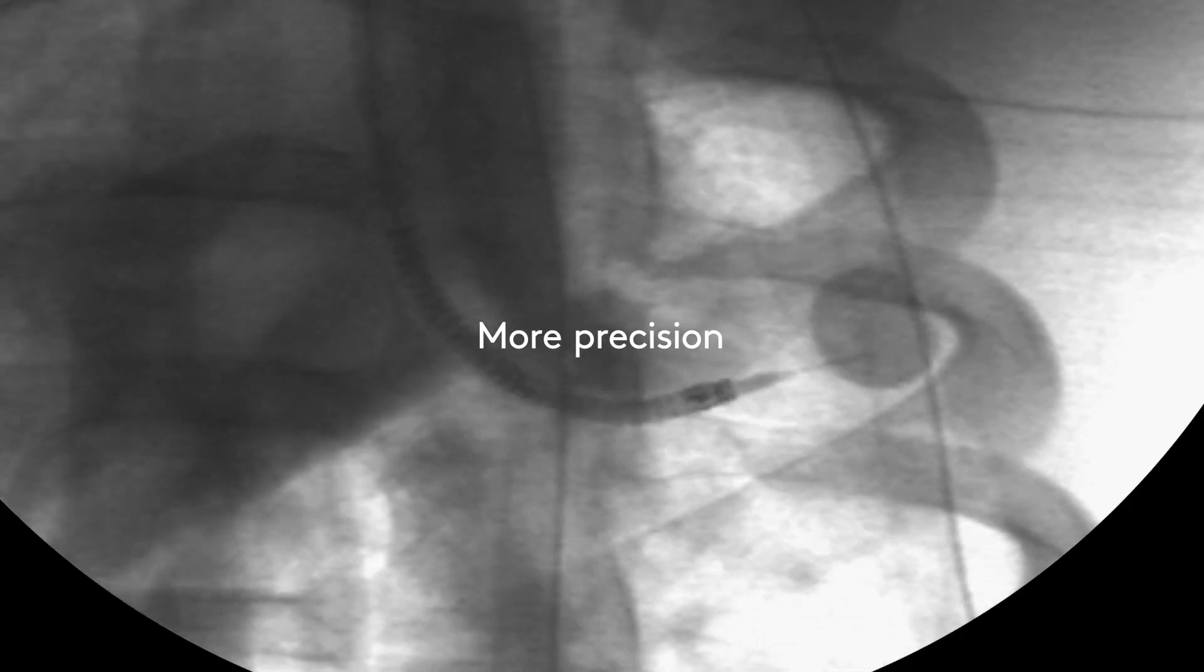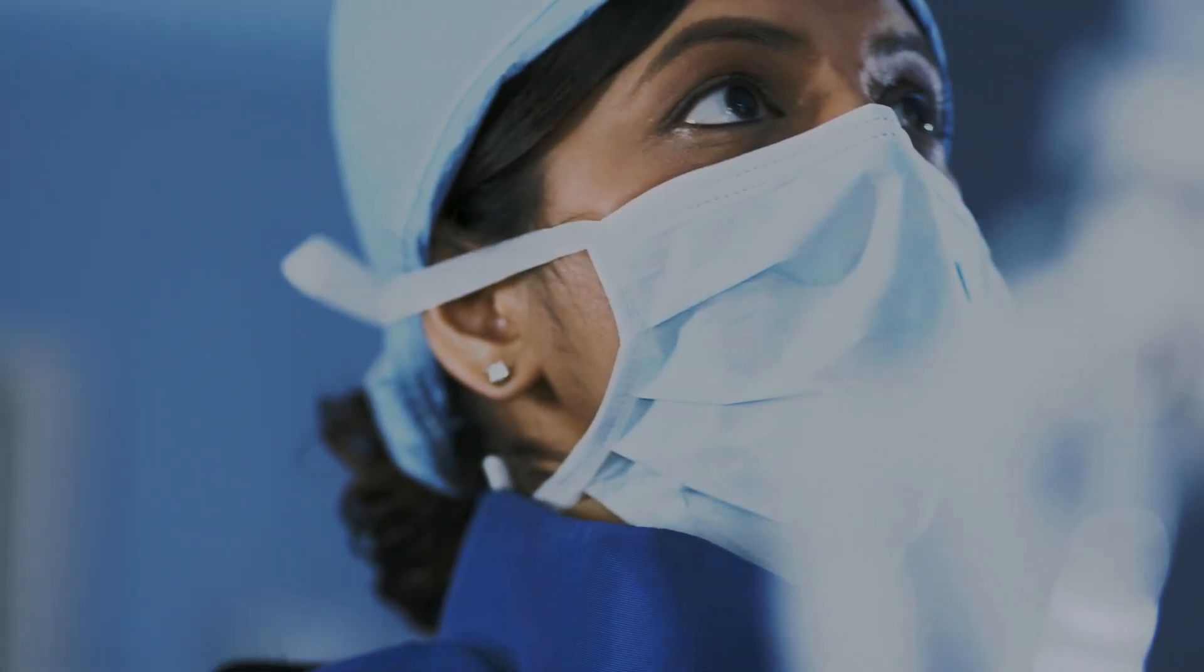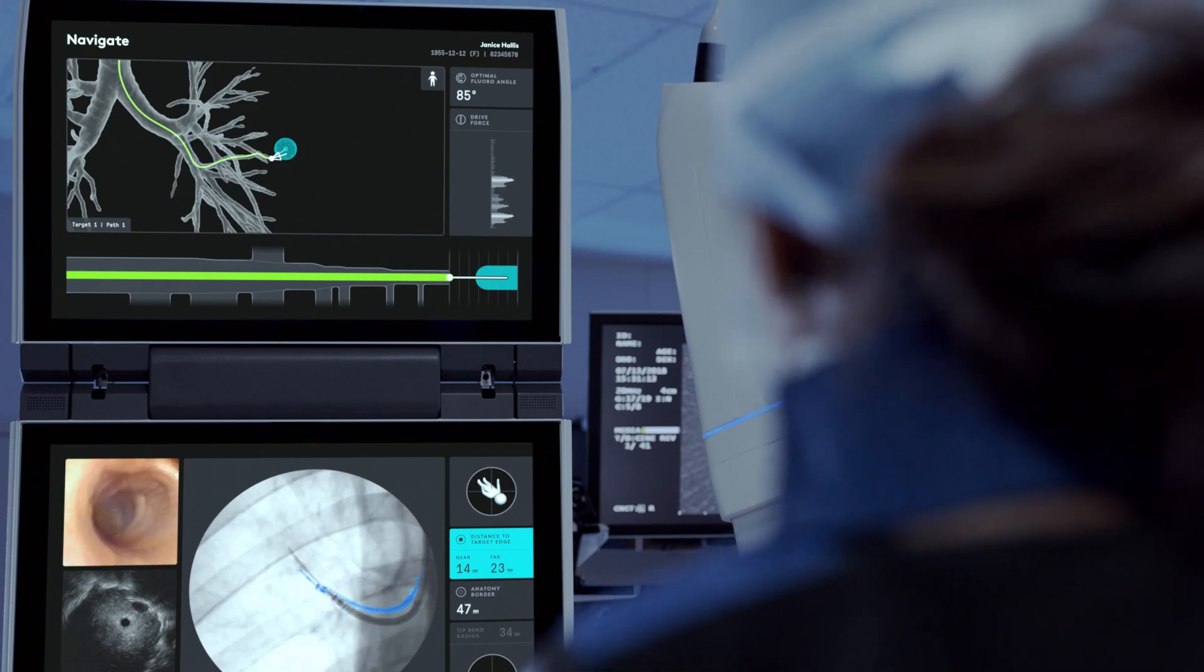ION is precise, delivering accurate biopsies of hard-to-reach nodules, even outside airways.